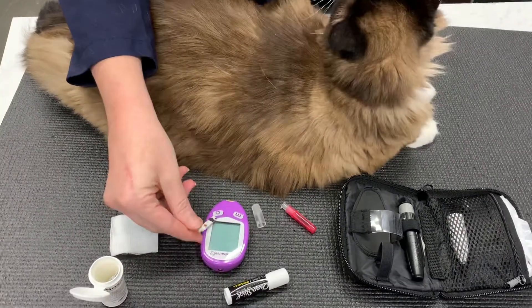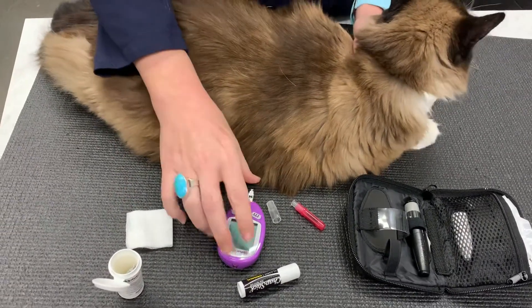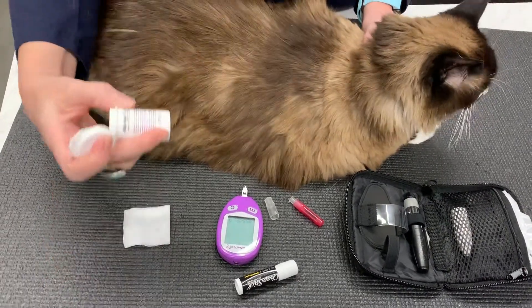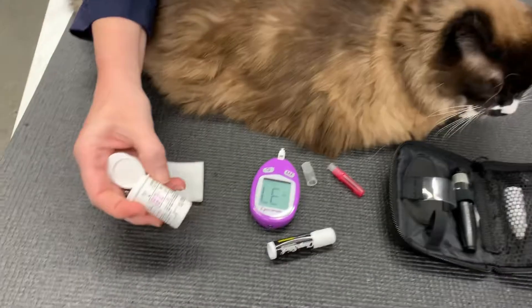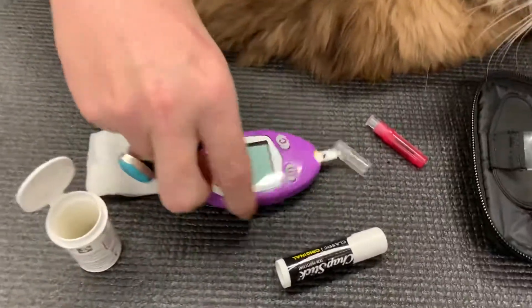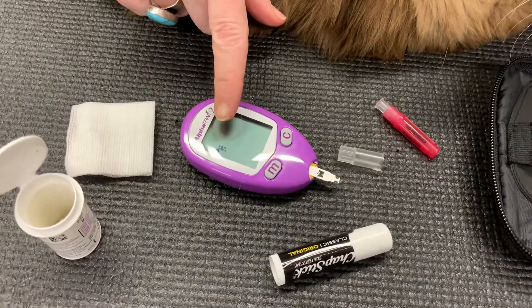We go ahead and put our test strip in since we're ready. We have the chapstick on the ear and all. We check to make sure that 37 is the cat setting, and that's exactly what it just said. Now it tells me that it's ready with a drop.